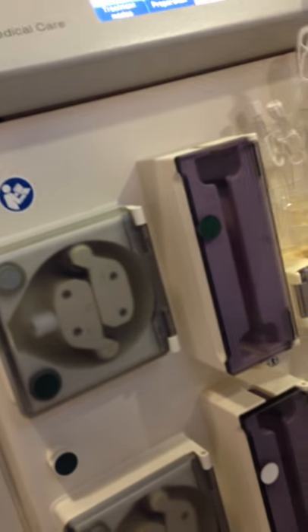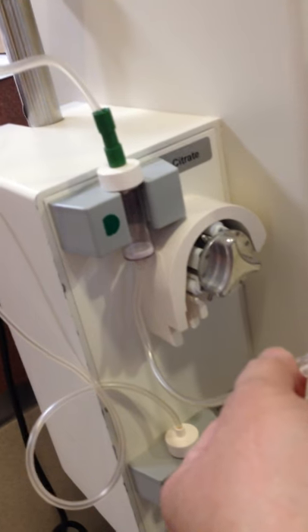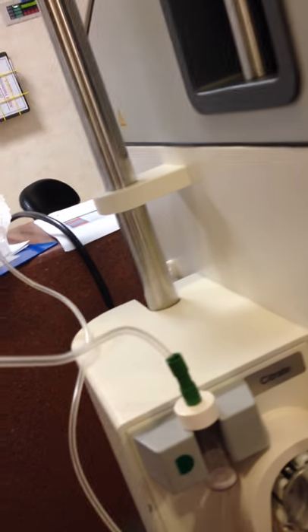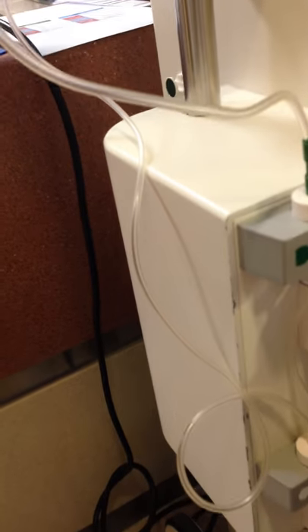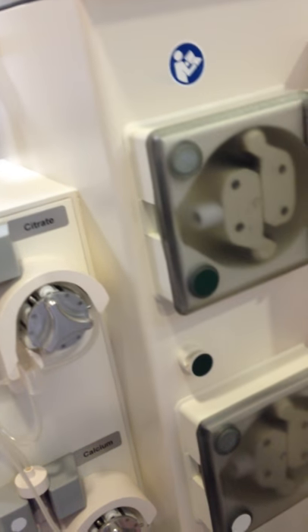Can we do it together? Where to pinch? One at a time. Pinch. Is it engaged? Are you guys engaging? Not yet. Still primed, still empty. Okay, leave it. Don't do anything. This one stopped already. So you have to wait.